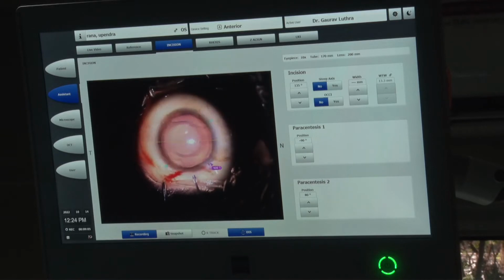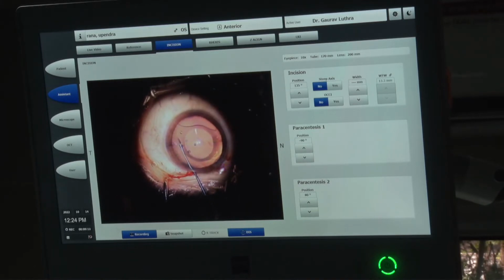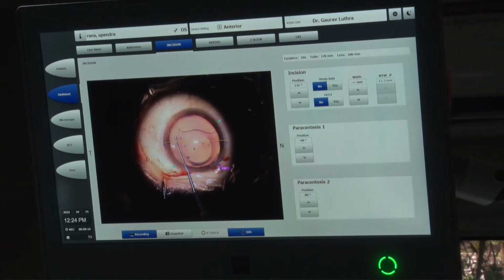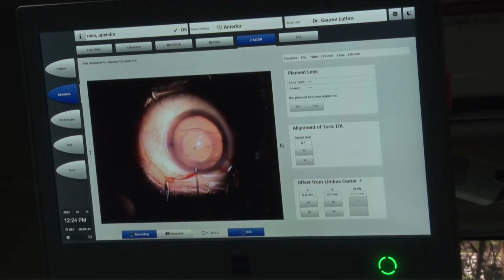Cornea. So you did very beautiful placement, looking at the position of the IOL. During the injection, while you were injecting slowly, you could see that. It's going good. The thing is, sir, that the IPCL you can rotate while injecting. Two things. One is that you can change the direction even while injecting, which you can't do much with the Star one. That's right.